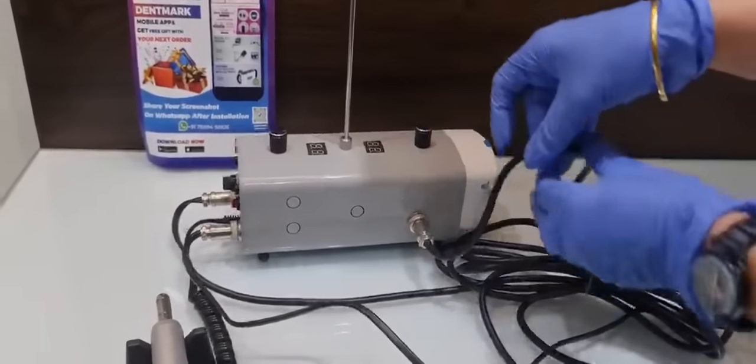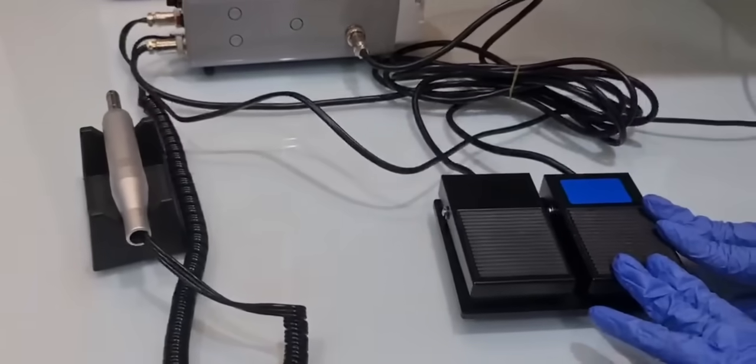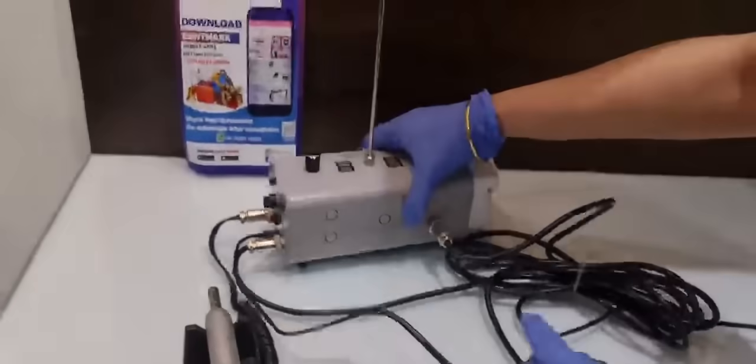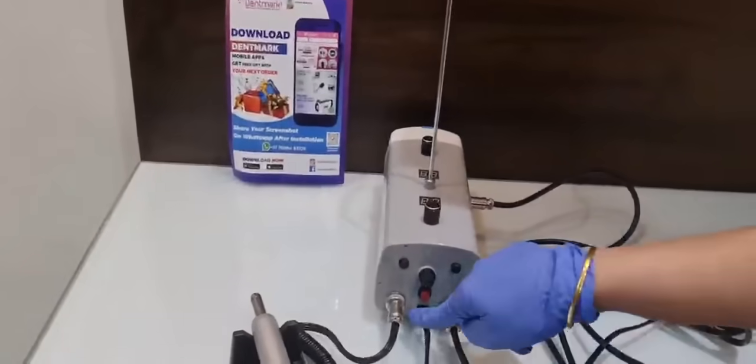This is the button where you need to attach this cord. This cord is attached to the foot control of the water pump. Apart from this there is one more cord which is attached to the electric power.